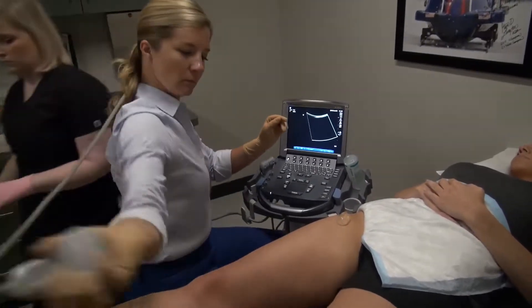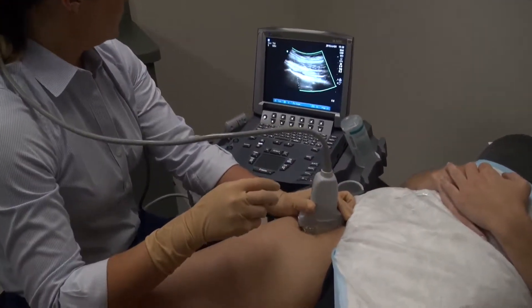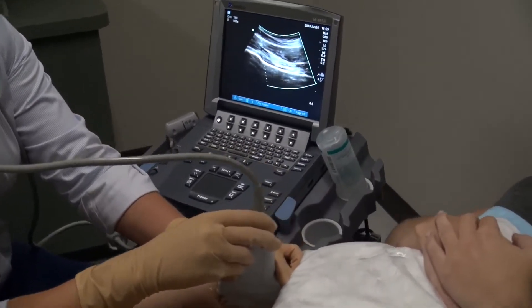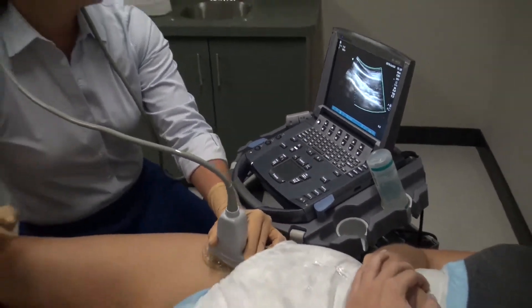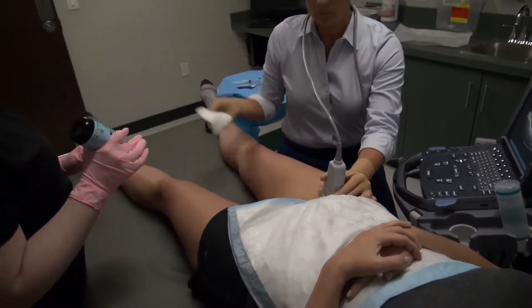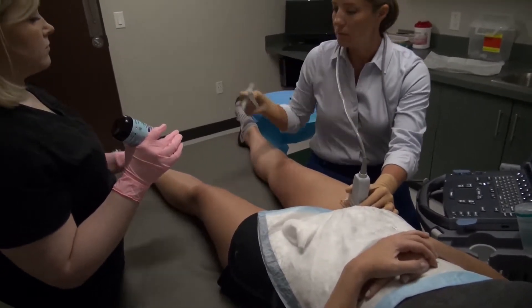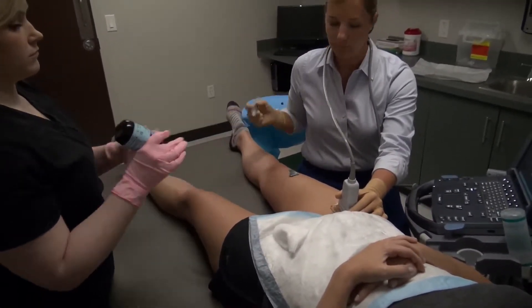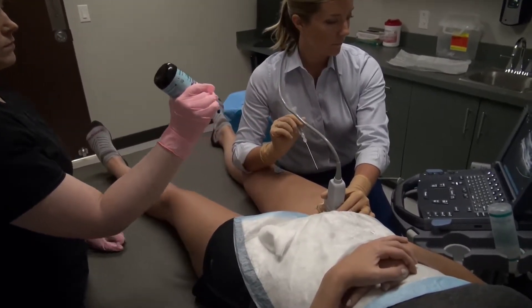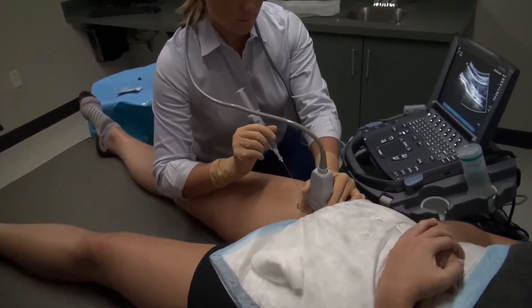The joint is then again visualized in long axis as far lateral as possible to avoid the femoral vessels. The excess gel is wiped away with a sterile 4x4 gauze. The skin is sprayed with ethyl chloride and the spinal needle is placed approximately one centimeter in front of the ultrasound transducer and inserted bevel up until it enters the joint capsule at the femoral head-neck junction.